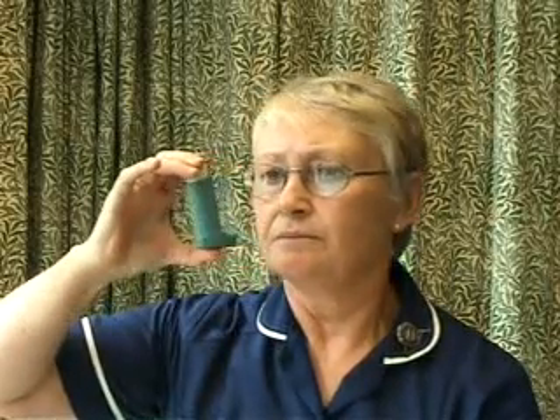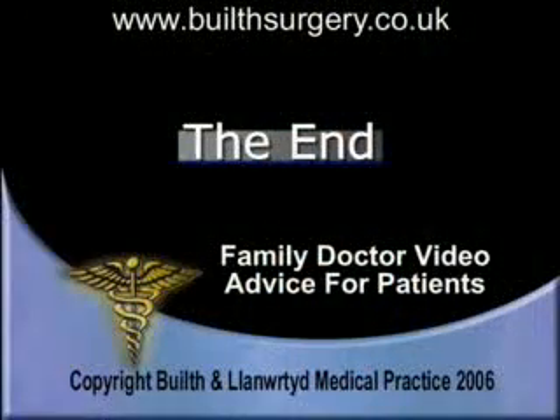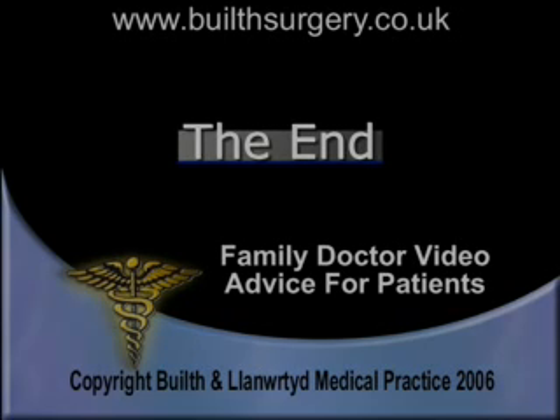I shall now repeat the technique in one flowing movement.